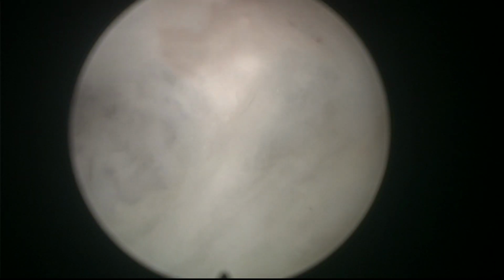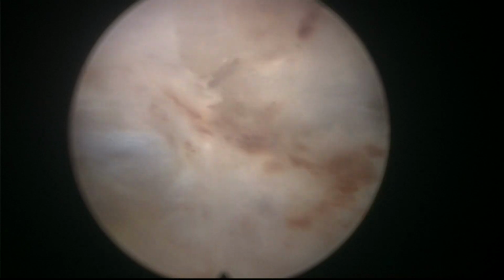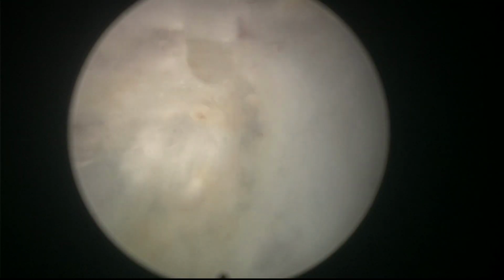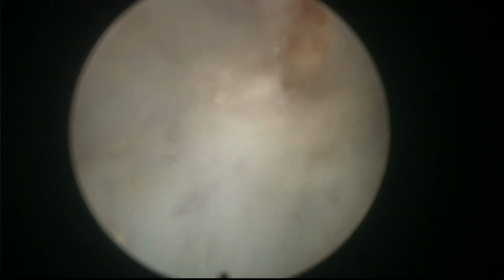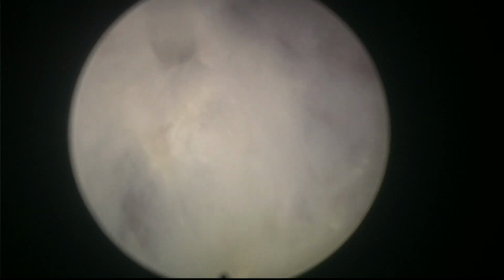And that is because sometimes the middle lobe pushes downwards and the lateral lobe pushes laterally. When you follow the plane below the middle lobe, it looks as if the plane would have to follow this curve, but then you go out and there's more. This case is not very visible, but often we see the lateral plane extends very laterally and it looks as if there were two planes. In the middle, there's a fibrous tissue, what I call the interprostatic ligament.